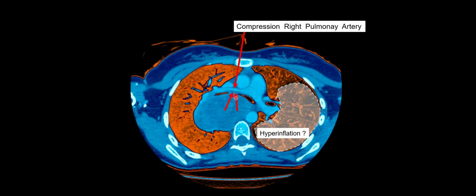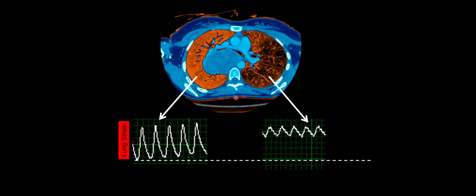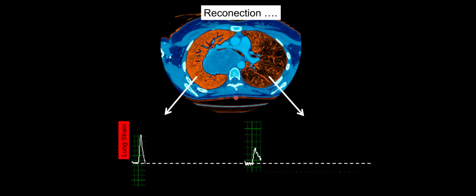But in this particular case, we did the analysis of perfusion and we observed bilateral perfusion, which means that there was no invasion of the pulmonary artery and this lung was preserved. And we can see that the big cause for hypoxia in this case was also shunt and a mismatch between ventilation and perfusion.